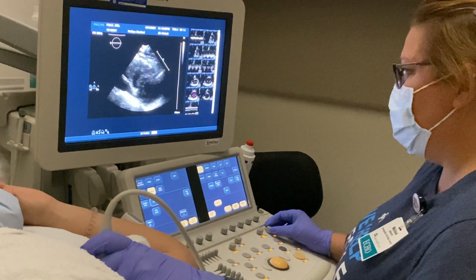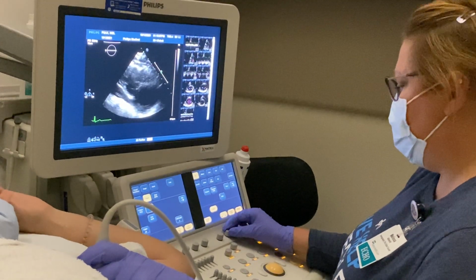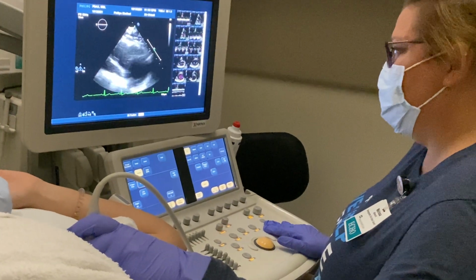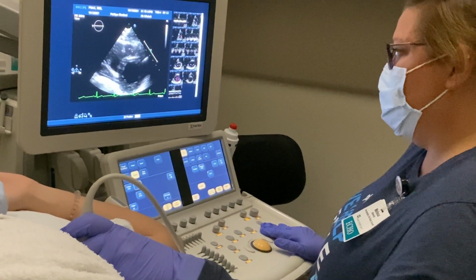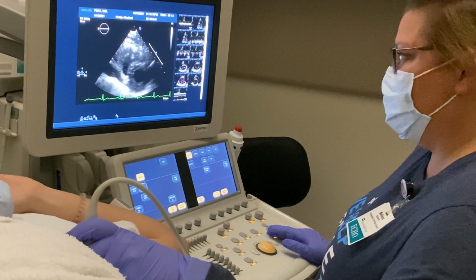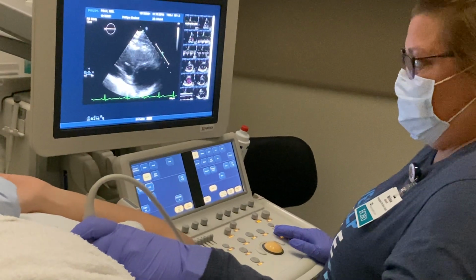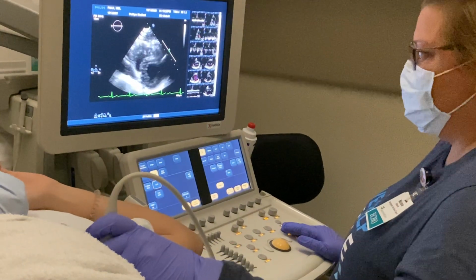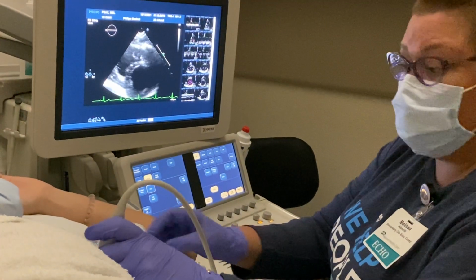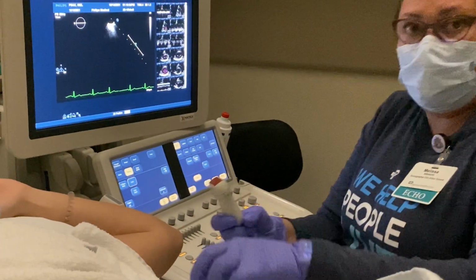Breathing techniques can be used throughout. I'm dropping my depth, I'm getting ready. And Abby, can you take a small breath in and hold it? So what the lungs did here was they pushed the heart into a little bit of a clearer view. And breathe. That's about as far as I can get, Chris. So that's the maneuver that we're gonna do. And that would be the end of this particular competency.